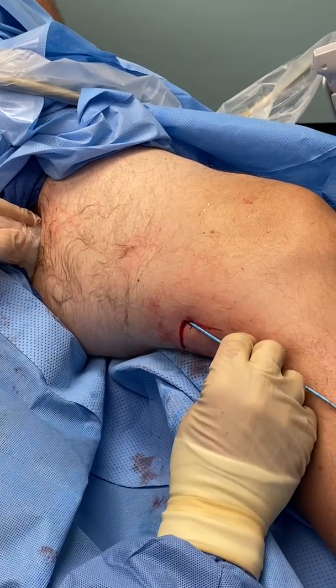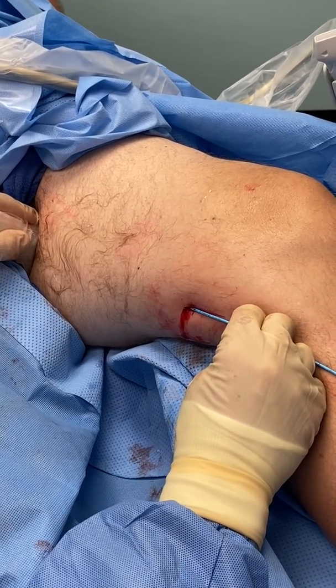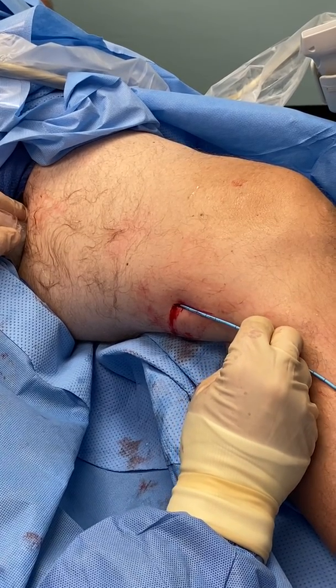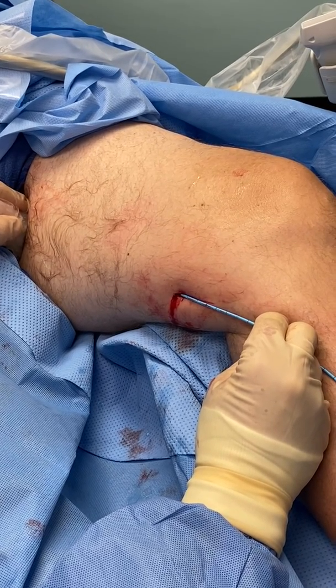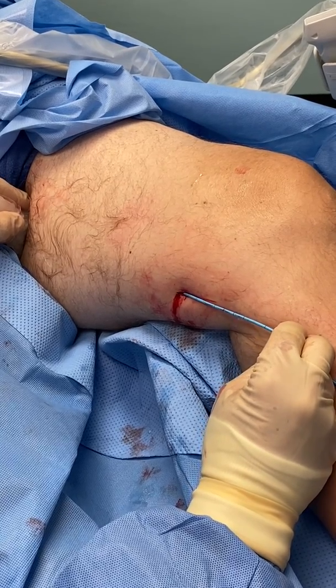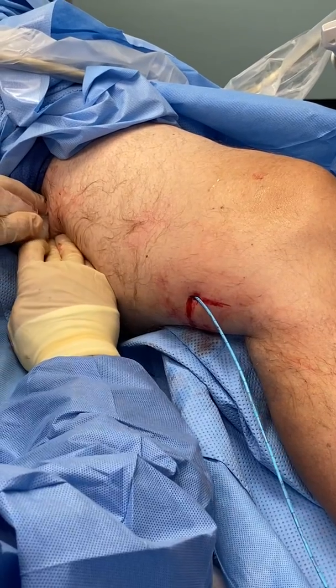We're going to give another aliquot. [Counting: one one thousand, two one thousand, three one thousand.] Compress. [Counting: one one thousand, two one thousand, three one thousand.] So we're going to compress the vein the same way.